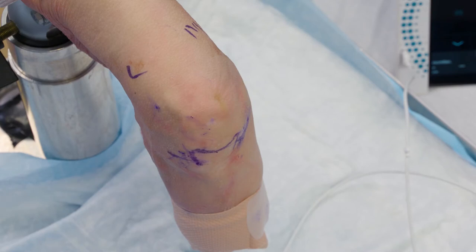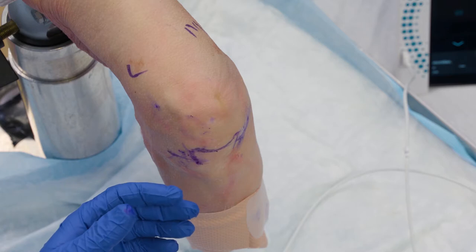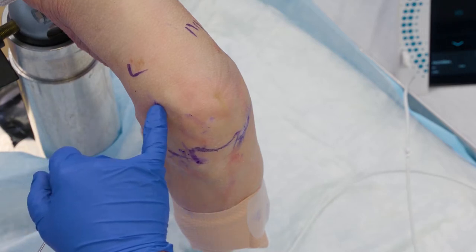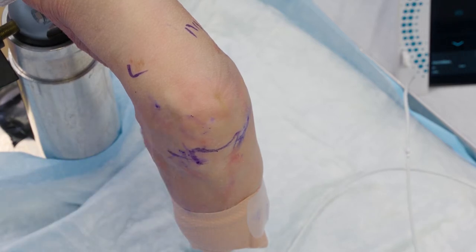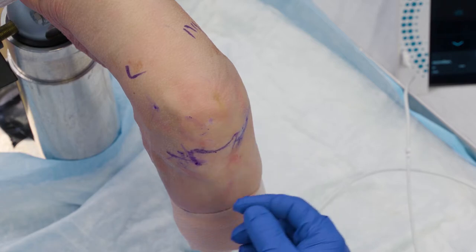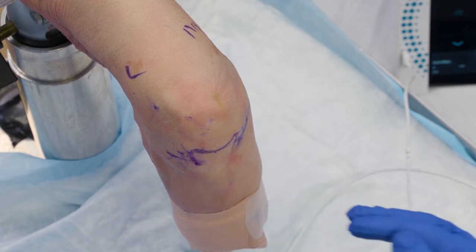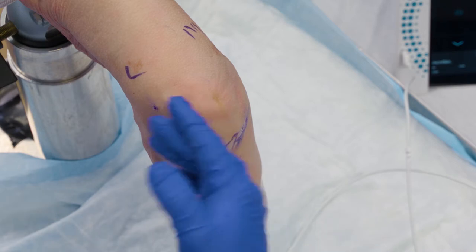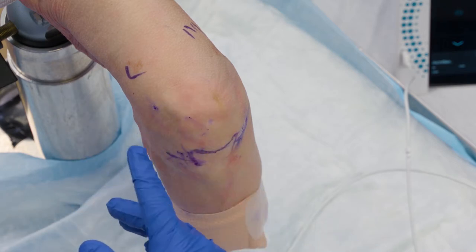What happens if you're struggling and can't get past the fat pad — which happens to all of us — perhaps with a larger patient or if you over-inflated the fat pad initially? One thing I've learned through trial and error is you can enter through the superior lateral portal. That will get you your bearings for the patellofemoral joint, and it will let you come across with an 18-gauge spinal needle through the medial portal to see a way into the joint while avoiding the fat pad. It gives me a direction and trajectory so I can keep the spinal needle in place, then withdraw my instrument from the superior lateral portal and come around.